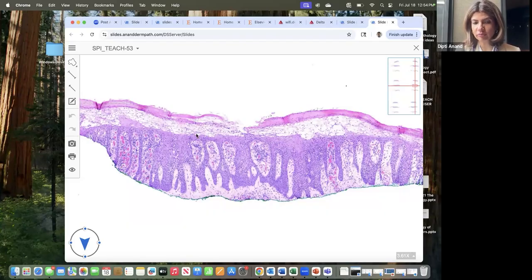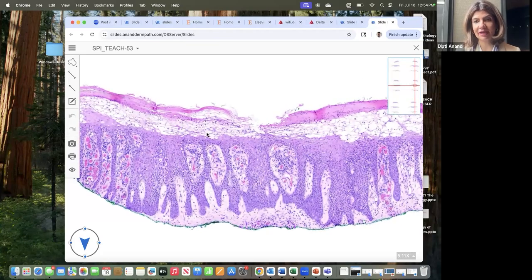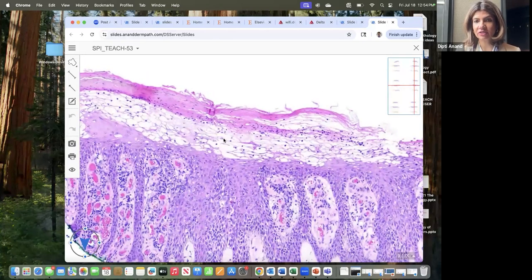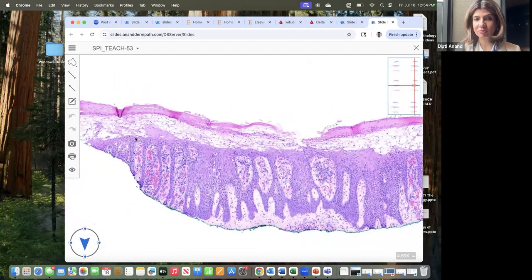The histology of which, the bottom of it looks like psoriasis. But the top looks like completely pale epidermis. There is pallor with confluent parakeratosis. The pallor is produced by these pale vacuolated keratinocytes. So you can see these really pale cells, and this is why this lesion will desquamate easily. You can see how it will produce a superficial blister because it will desquamate easily. So pallor of the top of the epidermis with the psoriasiform pattern in the bottom of it, that's a psoriasiform necrolytic disease.